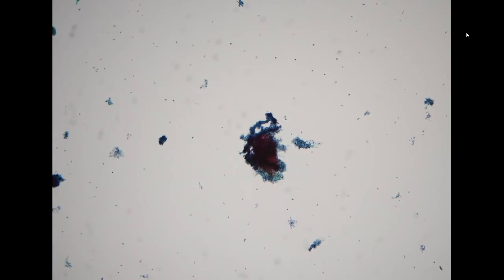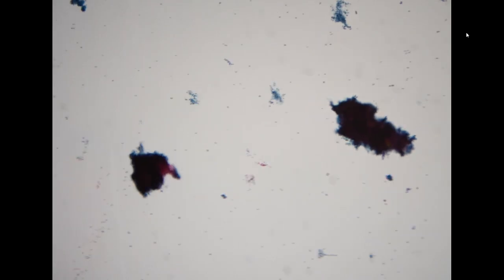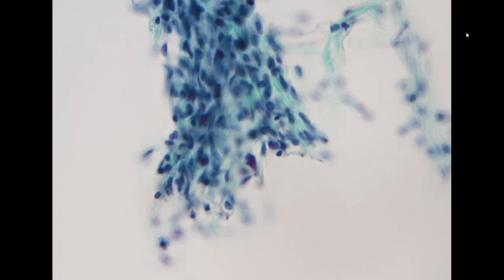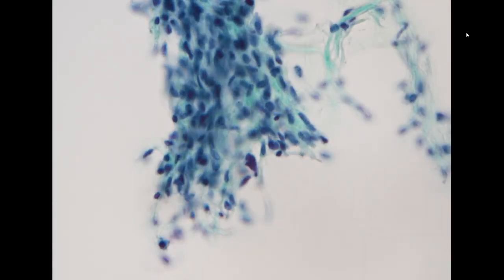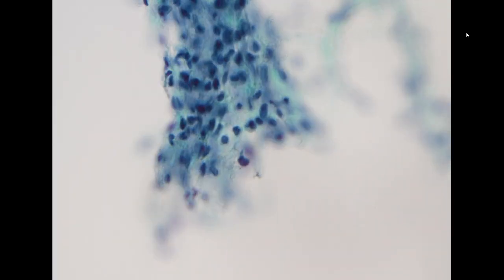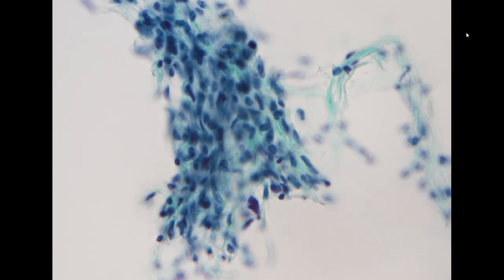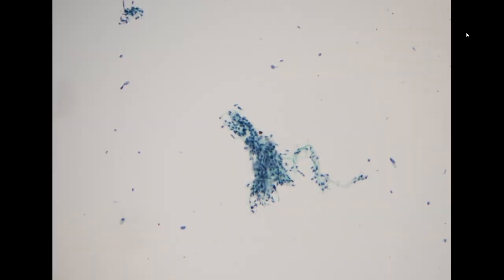So let's move to the fine needle aspiration. This is a parotid aspiration. This is a liquid-based preparation. We see a larger chunk of cells with this very tight cluster. When we go to higher power, the cells have an oval shape, fusiform morphology, along with some extracellular chondromyxoid type of matrix material. So these look like myoepithelial cells embedded in a matrix. So this looks like pleomorphic adenoma.